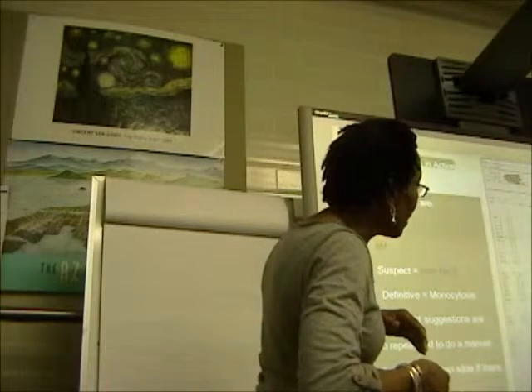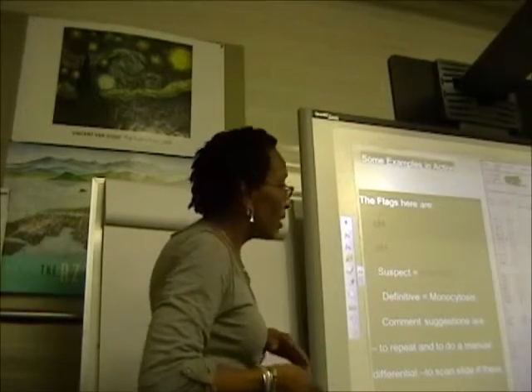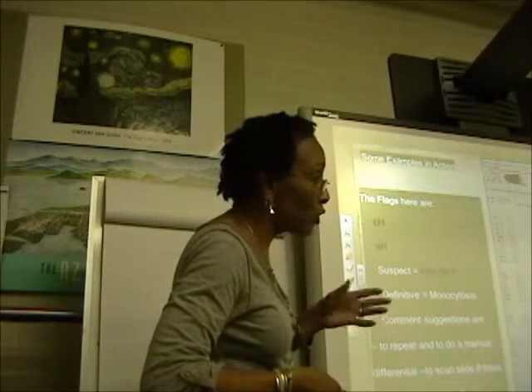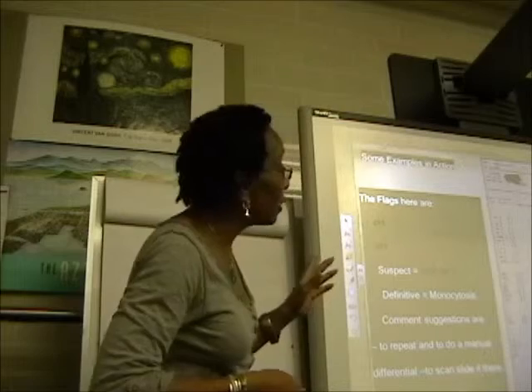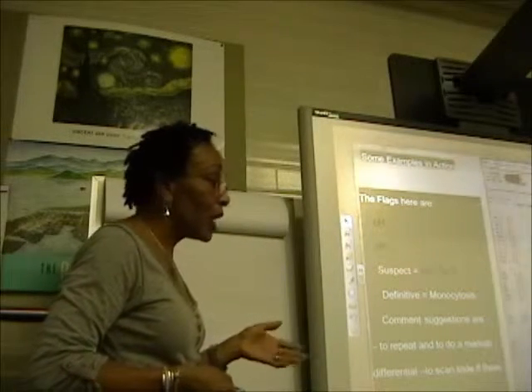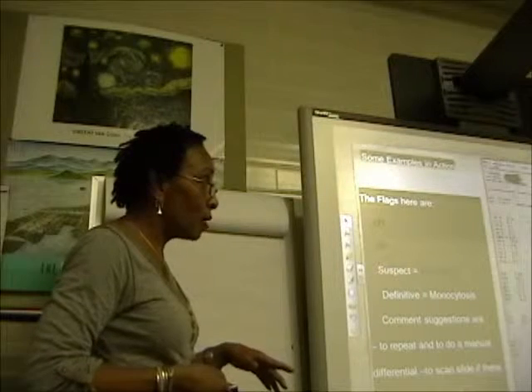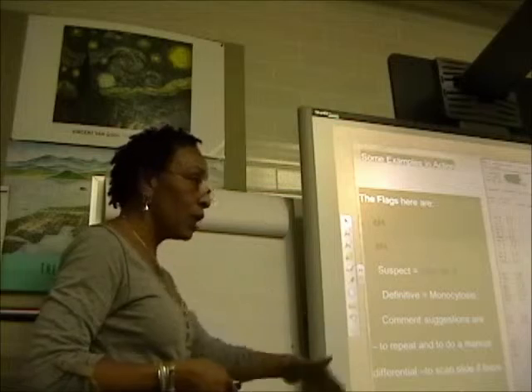So it's a critical. So you want to rerun it. You're going to have to rerun that, and on a different instrument to check and see if everything that's on this printout is actually true on the slide. Okay, and every time you get a critical, you're going to have to call the floor. You have to let them know that their patient is critical, and you can check the patient history to see where the patient has been trending. Like at a children's hospital, you called a certain floor, and they knew the patients. They came in pretty regularly.